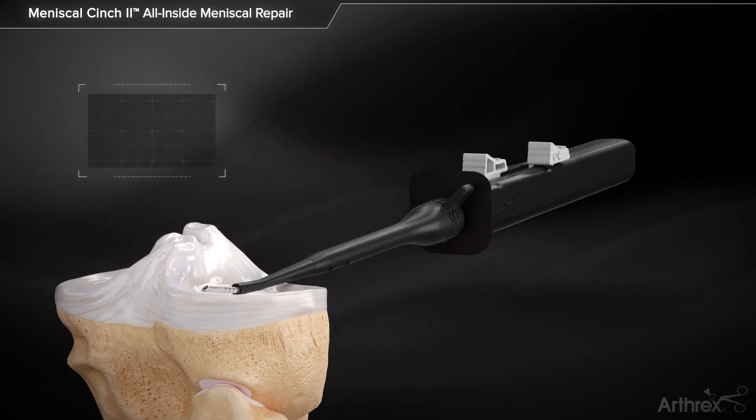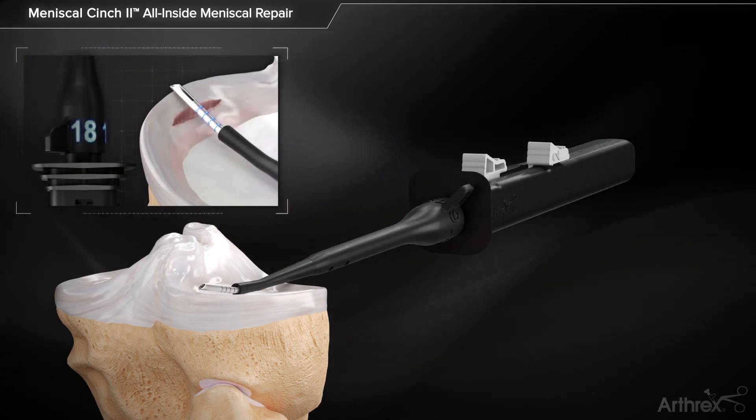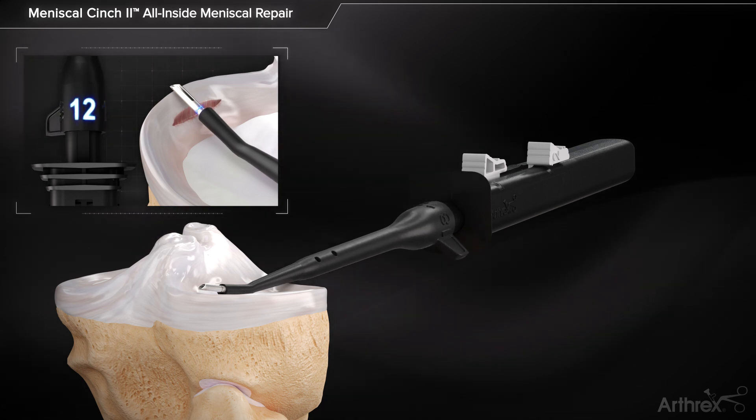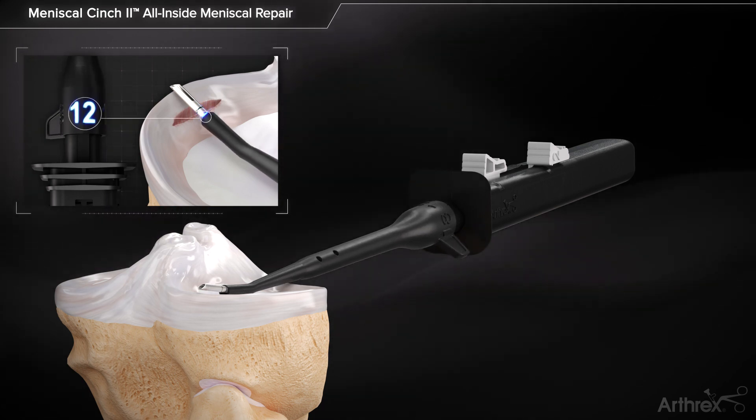The meniscus is measured using the laser lines on the tip of the Meniscal Cinch 2 needle. The depth stop is set according to the measurement by rotating to the desired depth with the desired number facing upwards.